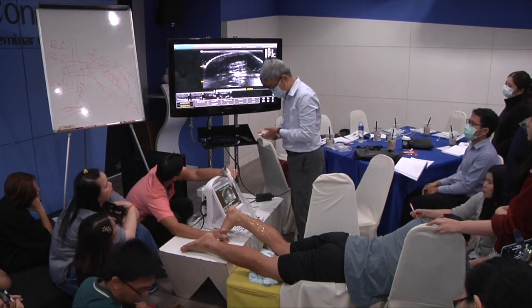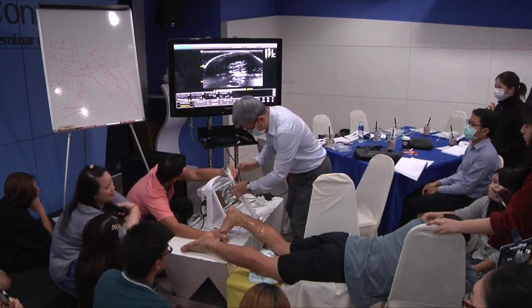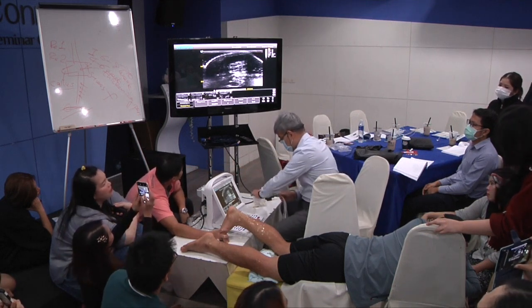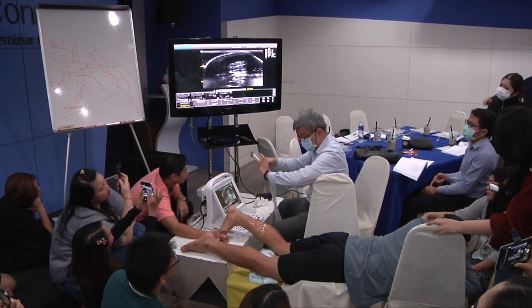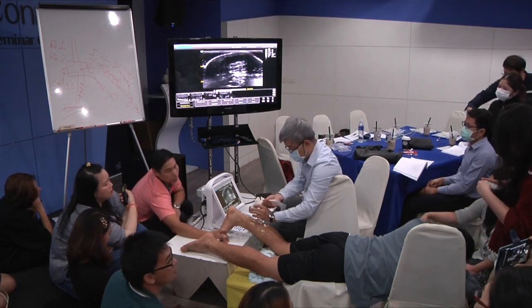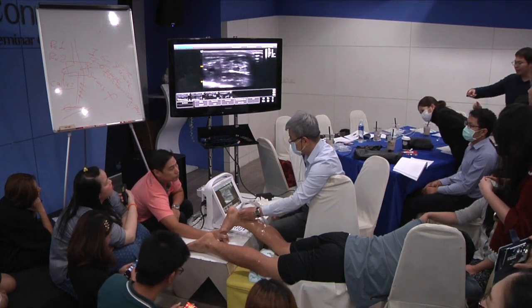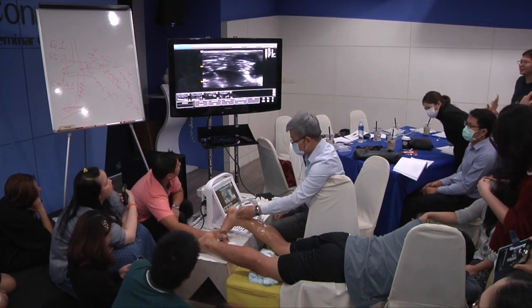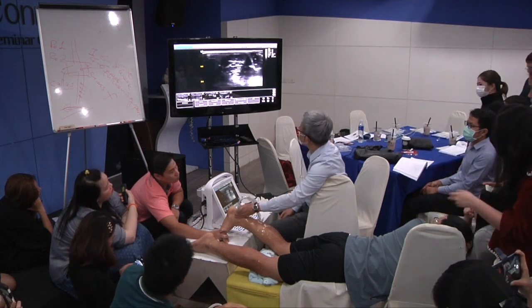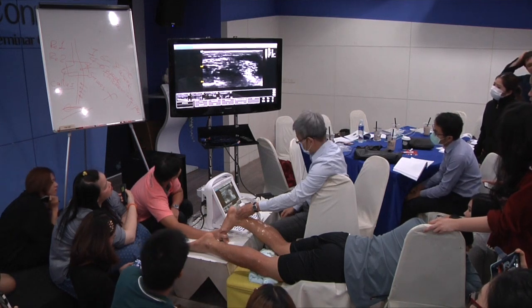Okay, thank you very much. Yeah, good. So when I look at the plantaris, the color is slightly different.